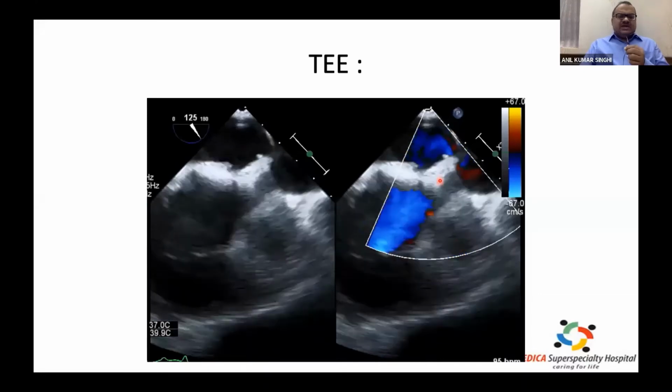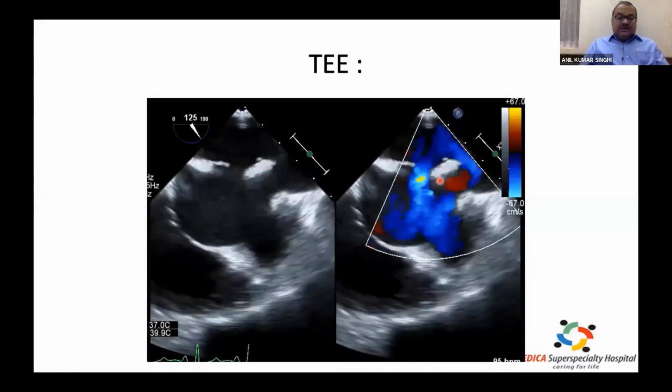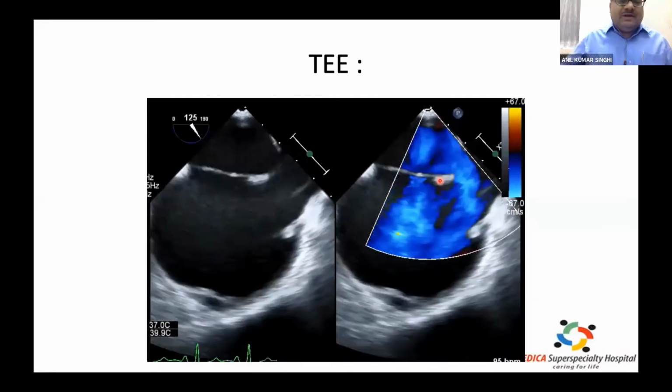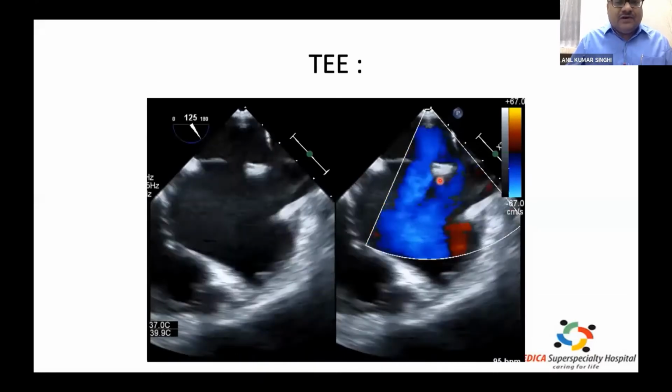And once we have found an additional large sinus venosus ASD, the case no longer is favorable for any transcatheter intervention, though nowadays we are trying a little bit. So it was sent for surgery.